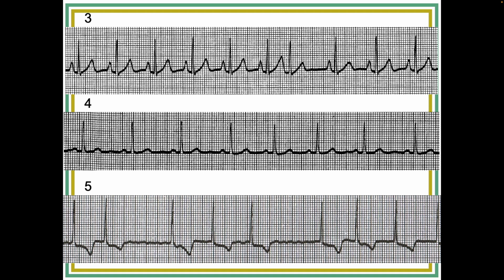What should jump into your head at that point? AFib. Yeah, you'll get it, you just have to keep practicing. Let me tell you one thing though, the slower the AFib, the harder it is to see on the 6 second strip, because you just don't have that many. Now, I lied, I want to do one more. Ann, can you do one more?